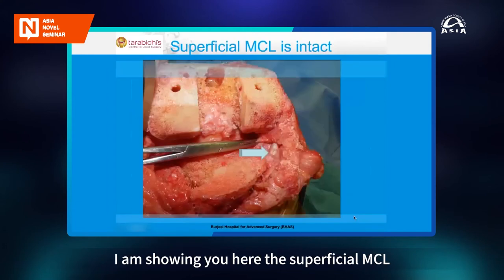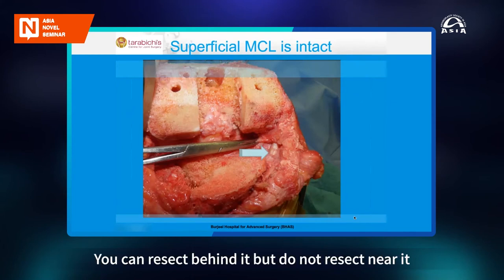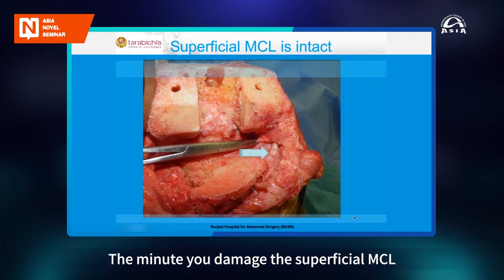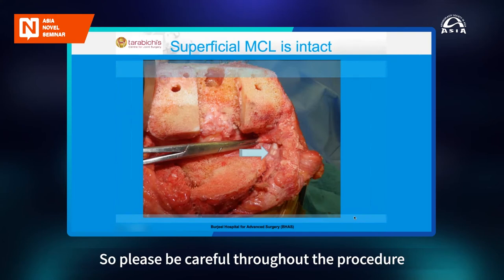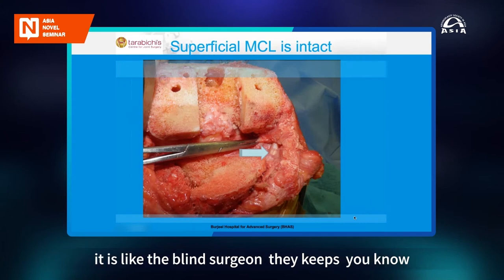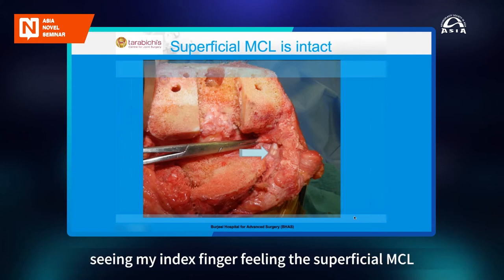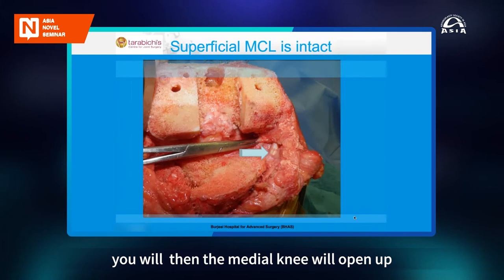Doing all of that, I'm showing you here the superficial MCL. Please feel it with your finger all the time. You can resect behind it, but don't resect near it. The minute you damage the superficial MCL, you're done. You're talking about a CCK implant. So please be careful throughout the procedure. I always feel it. I sometimes tell my fellow, it's like the blind surgeon. They keep seeing my index finger feeling the superficial MCL, because the minute you resect it, the medial knee will open up.